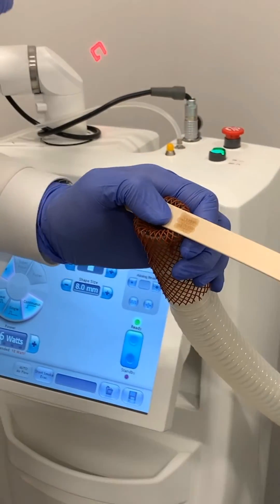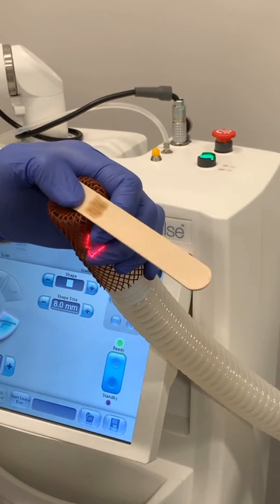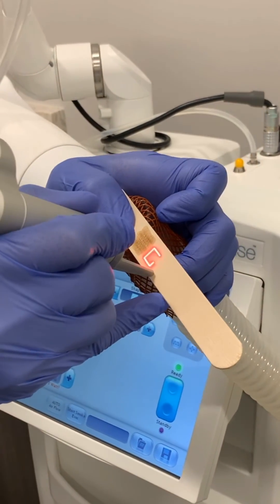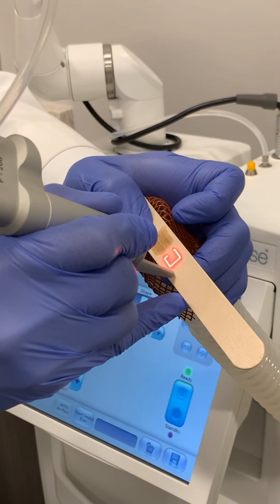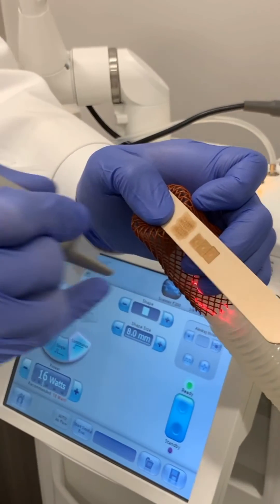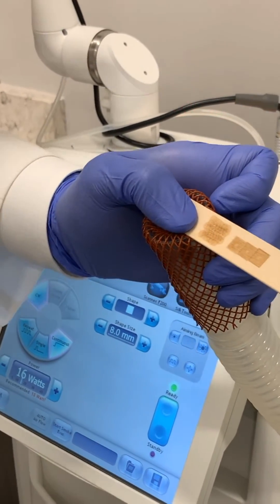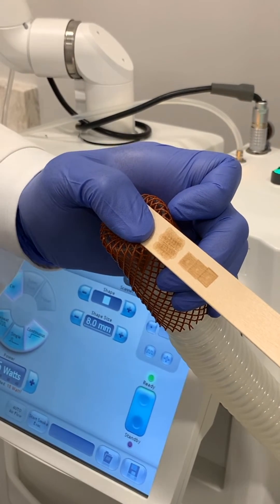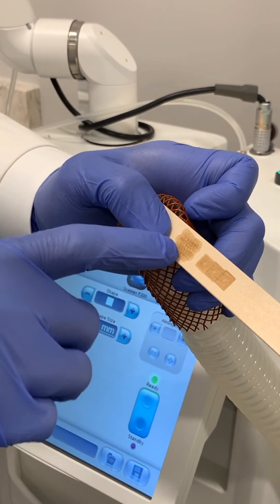On the other hand, with the fully ablative CO2 laser — our AccuPulse laser — I'm going to put it right next to the Erbium laser and just fire it a few times. What it does is it ablates that entire area, and the heat generated by the CO2 penetrates much more deeply than the Erbium.